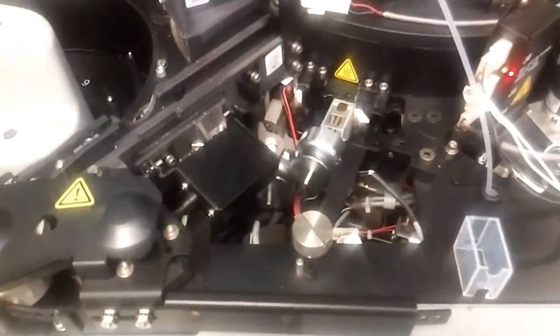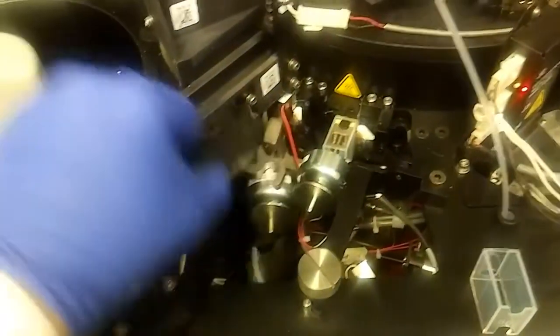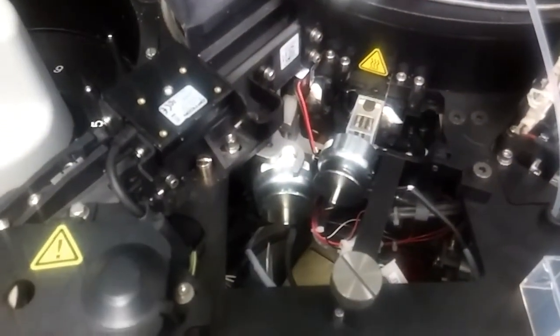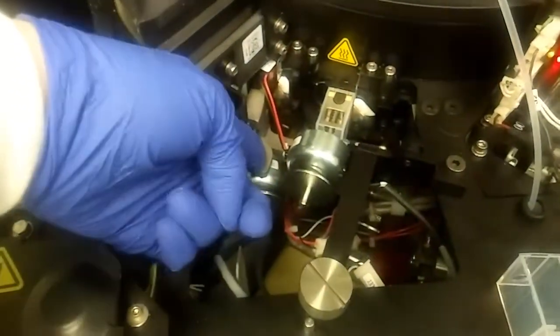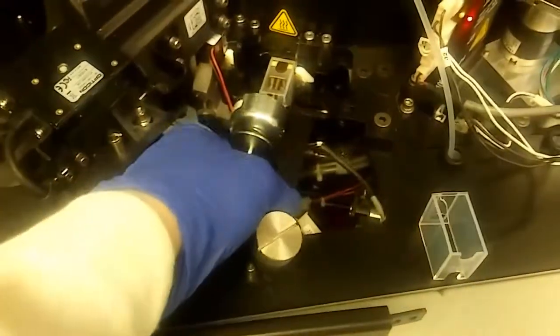Once you press that button it unlocks this part right here. First you want to pull this up, then pull this out — you'll hear it click. Then you want to unscrew this knob and set it back. Now you're free to pull this out and take the cuvette off.